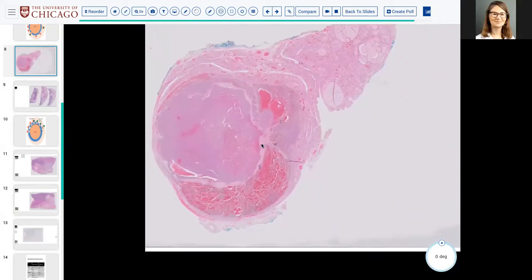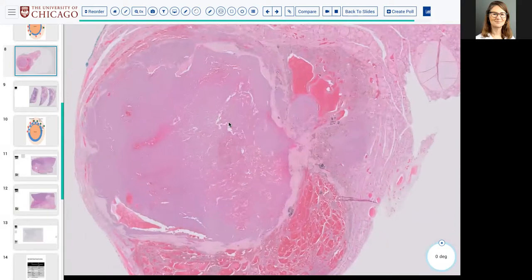I feel like you can imagine the needle sucking a portion of the tumor out through that little hole. It looks like one of those fish that have little kissy mouths or something. Like you can see it squeezing out. Yeah, exactly. So I'm not sure that you would be wrong either way.